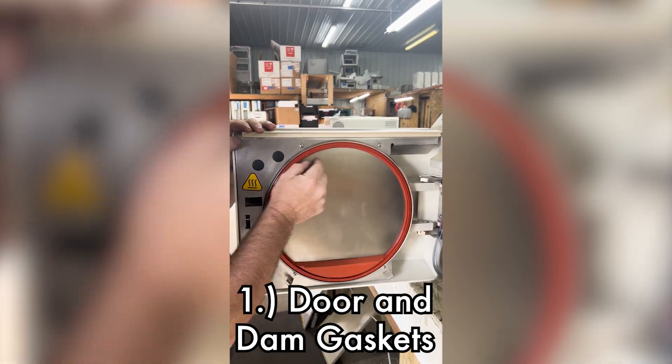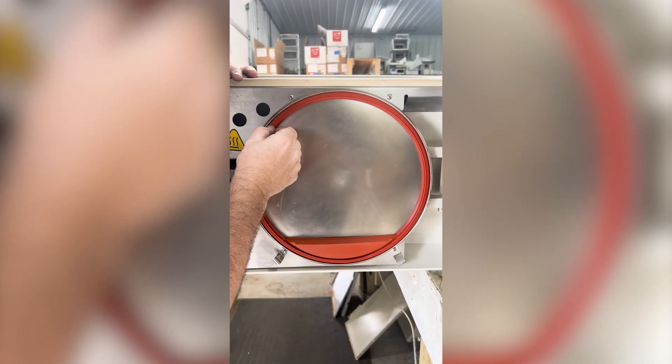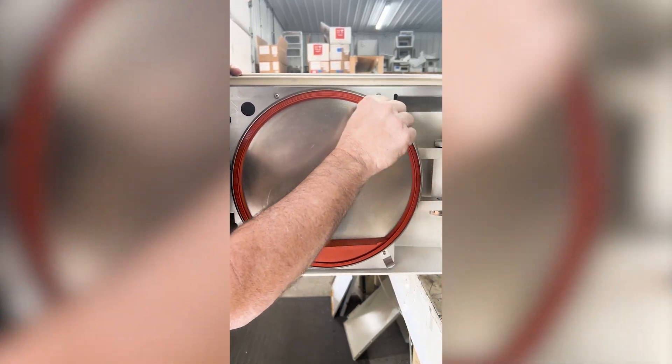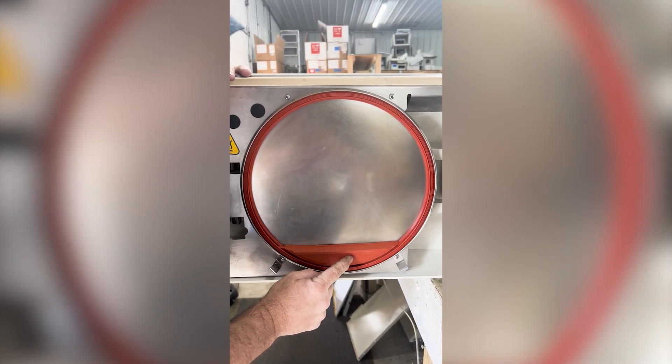These gaskets should be replaced every six months. What's going to happen is they're going to start drooping — they're not going to stay in their groove very well, so you're going to have steam loss. Now we're not looking for tears, rips, nothing like that. They just compress. So every six months, change both door and dam gaskets.